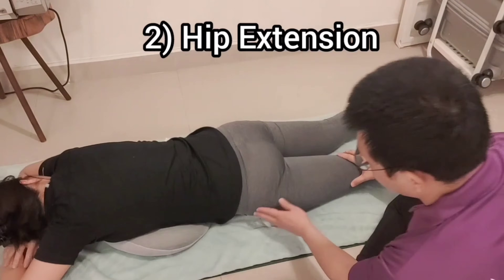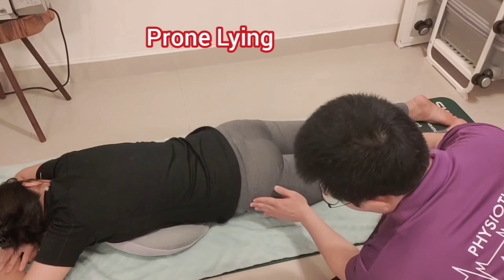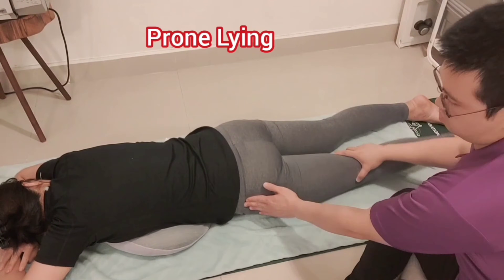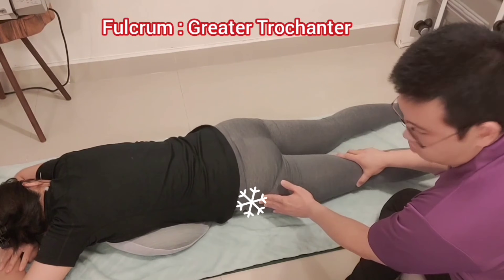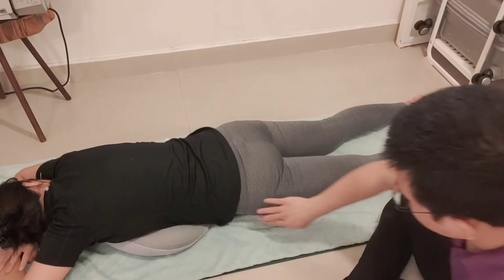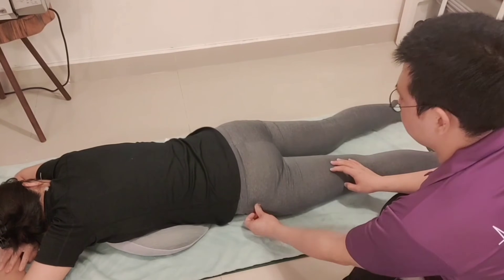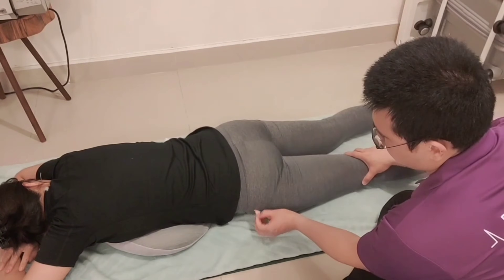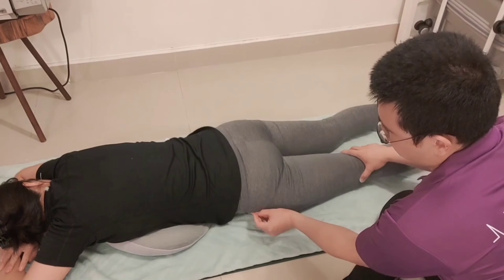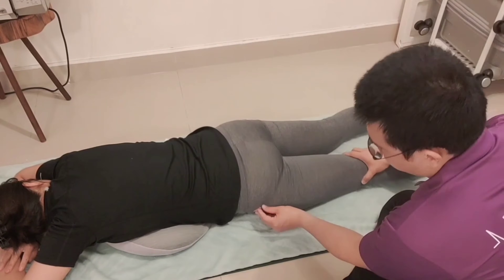Number two: range of motion of hip extension. Now the patient is in the prone lying position. I'm trying to find the fulcrum — the greater trochanter — by externally and internally rotating the hip joint, then attach the sticker to the fulcrum. External and internal rotation of the hip joint makes it easier to palpate the greater trochanter.